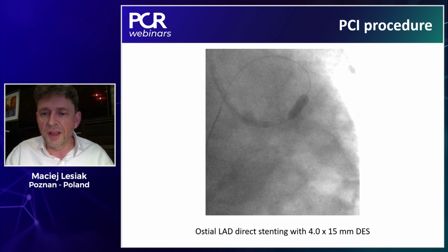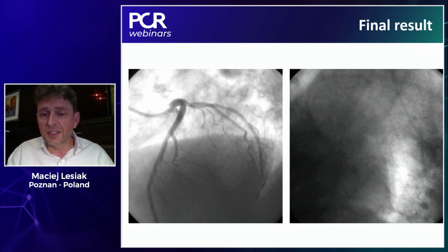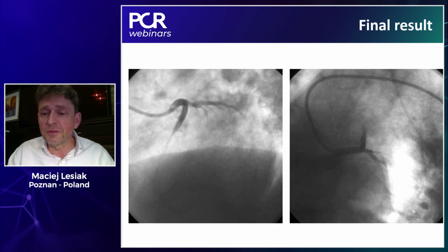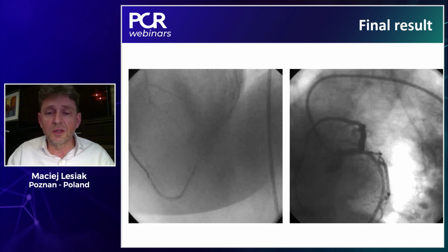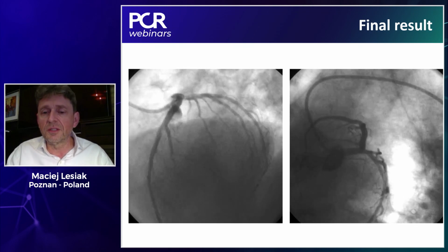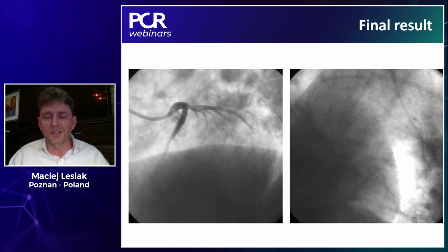So you see the still frame, and they believe that they are just right at the ostium of the LAD. And actually, they were very successful. So you can appreciate a very nice early result of the procedure. The patient became asymptomatic, and the patient was released just a few days after, without any further sequels. So this strategy proved to be very, very successful in this acute phase.